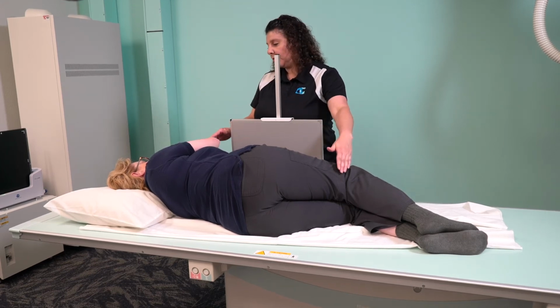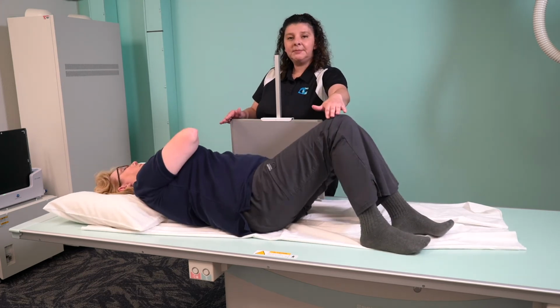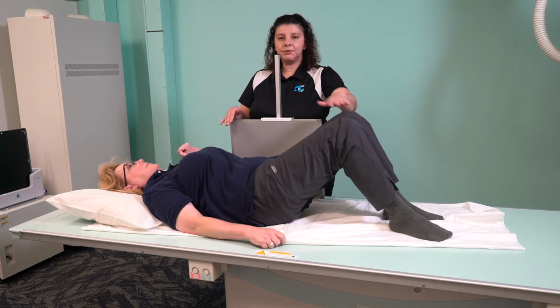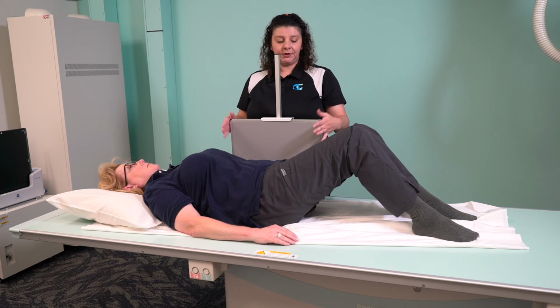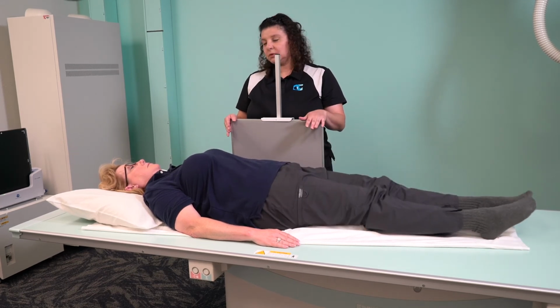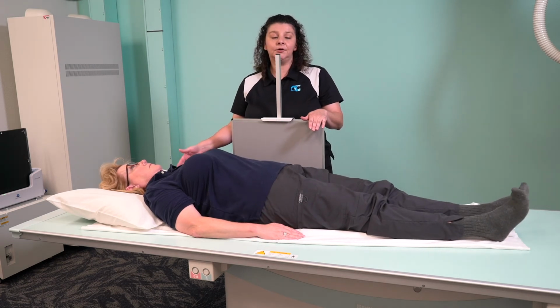Okay, now if you'll roll back onto your back. I'm still keeping a decubitus position. My central ray is horizontal, my image receptor is vertical, but now we are in a dorsal decubitus position because my patient is laying on her dorsal side, her posterior side.